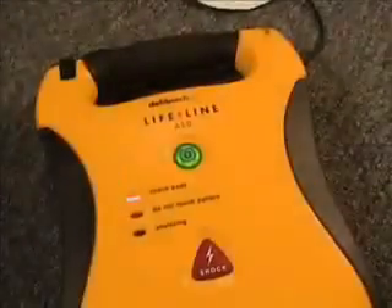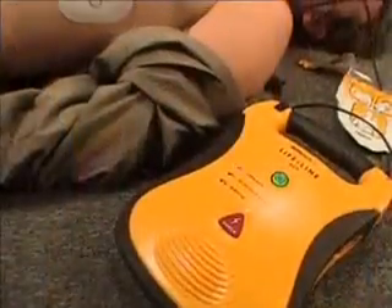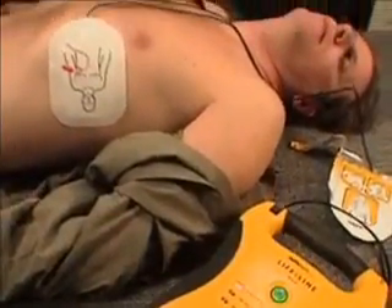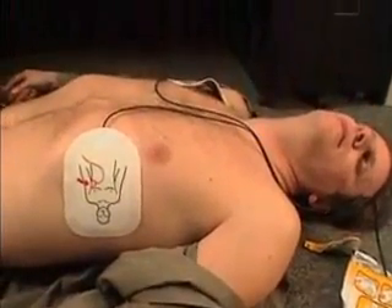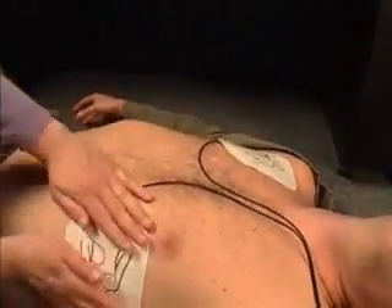Poor pad contact to patient. Press pads firmly. The unit automatically checks the connection of the pads to the victim and lets you know if the connection is bad. Make sure the pads are properly attached to the victim and not touching each other. If needed, reposition the pads and dry or shave the victim's chest.